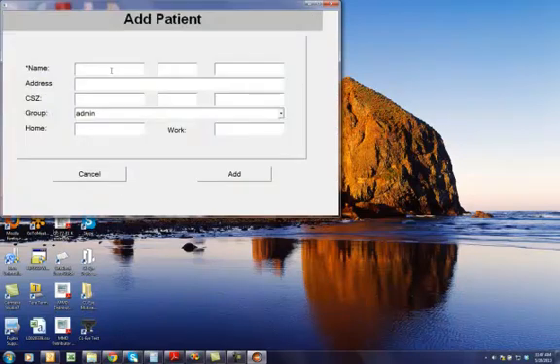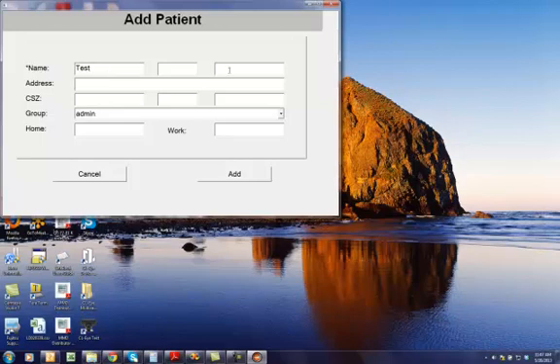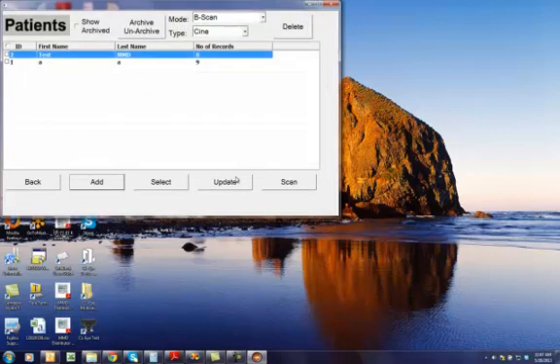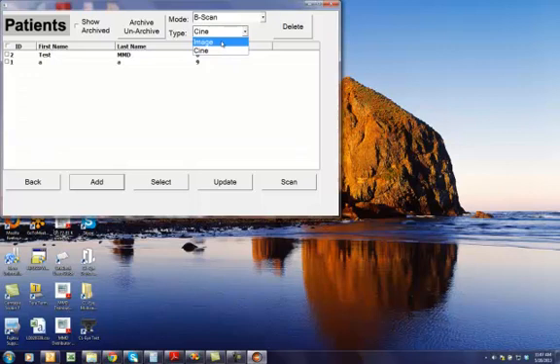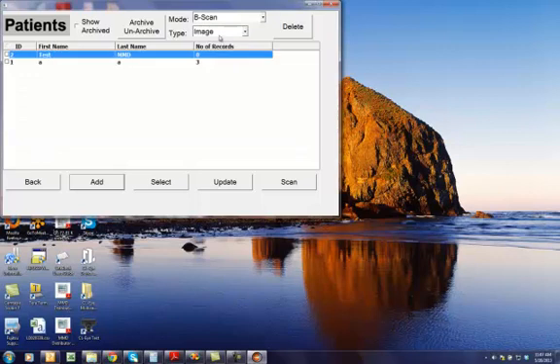So, I will add a new patient, I will say Test MMD as the name, and click Add. Test MMD will get added. Right now it has no records in Cine or Image.